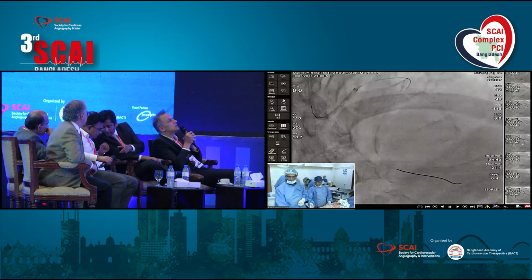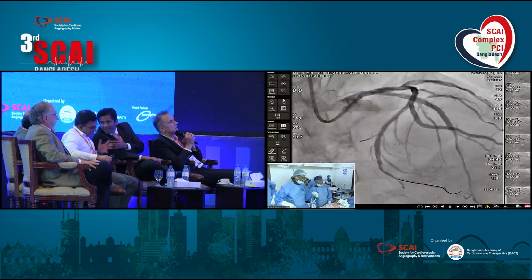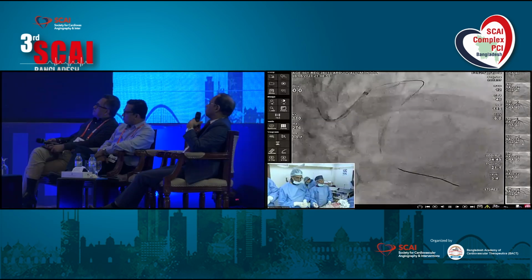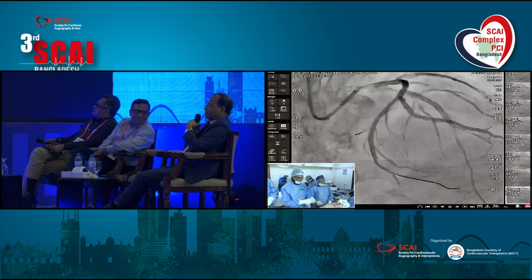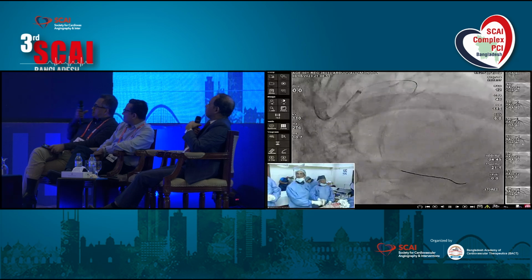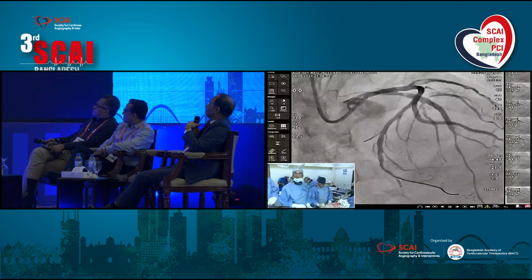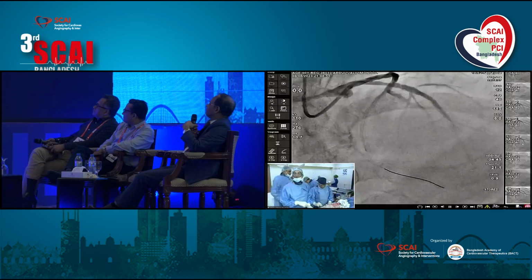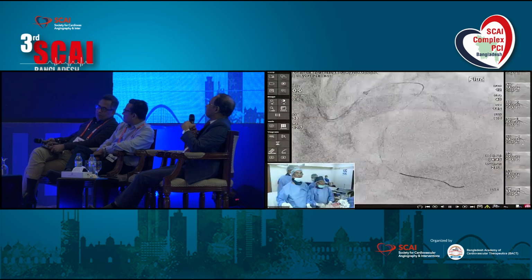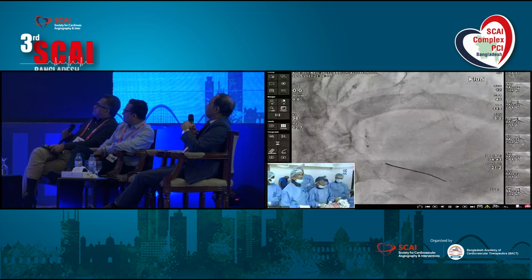Dr. Omar, I did not understand what you are saying. He's telling that your predilatation of the lesion was not adequate. Yes, but with the 2.5 balloon there was no dog-boning, and that is why we thought that if we give the stent and post-dilate the stent, it will also cover where the calcium is. But at the end of the day, the procedure seems to be very good looking, so we hope it will work well in future.